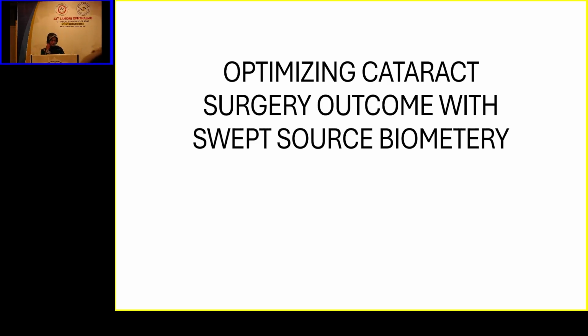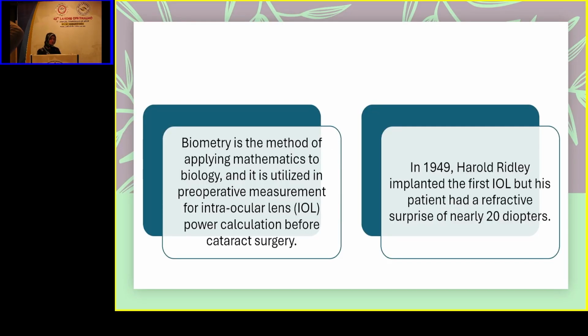Assalamu alaikum. My name is Dr. Sharoon, and we'll be talking about a new biometer that we've recently acquired at our setup and our real-world experience with it. So the topic is optimizing cataract surgery outcomes with swept source biometry. A brief look at the definitions of biometry and a brief history.